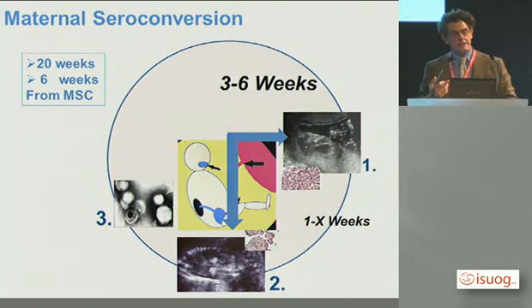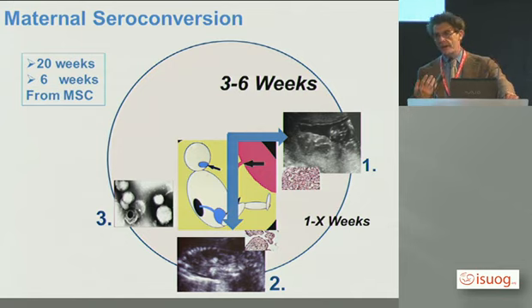One reason for that is that the infectious process is a dynamic one. When the woman catches the bug, she will go into about 6 weeks incubation. Then that bug is going to try and go through the placenta, so the placenta is going to struggle first. Once it's overwhelmed by the bug, it is going to let it through and behave itself as an abscess. So the earlier signs you may see is placentitis, thick placenta, heterogeneously looking placenta.